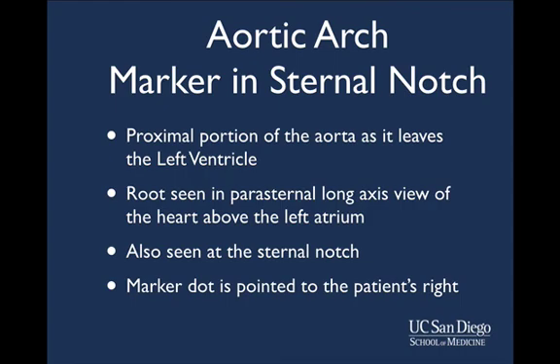The next view I would like to go over is the aortic arch. We place our marker in the sternal notch. The proximal portion of the aorta is visualized as it leaves the left ventricle. We will not see the root of the aorta well in this view, as that is better visualized in the parasternal long axis view of the heart above the left atrium.